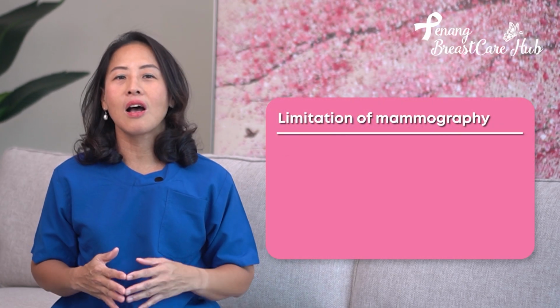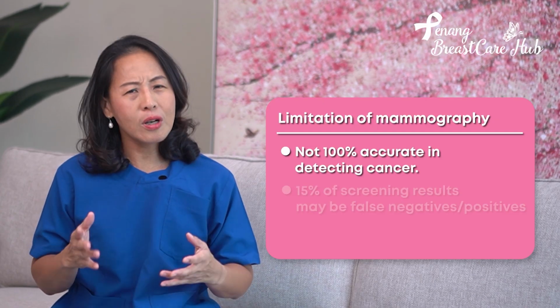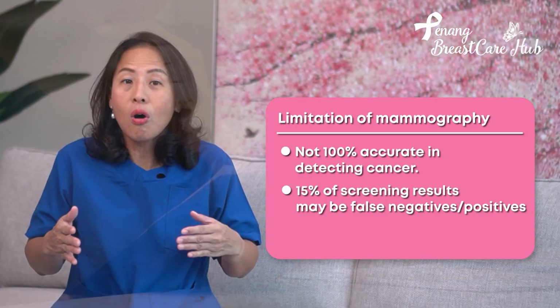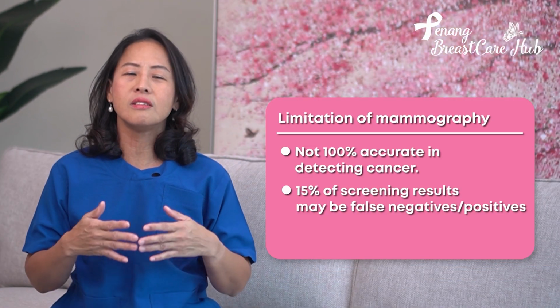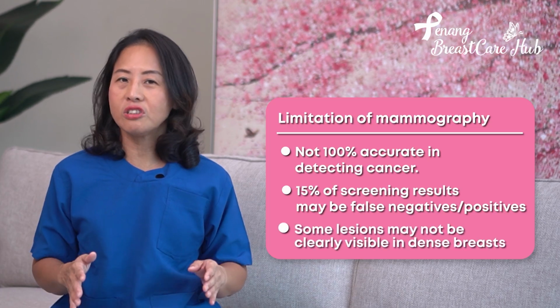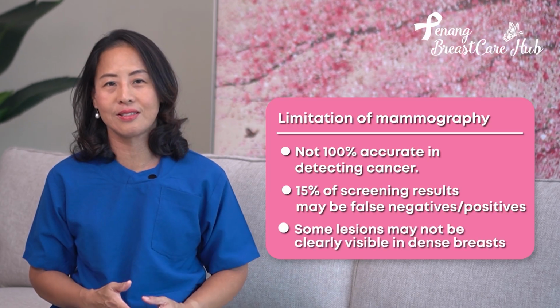Screening mammograms are also not 100% accurate in detecting cancer. Approximately 15% of screening reports can be false negative or false positive, resulting in unnecessary anxiety to the patient. Some lesions are also not well seen on mammography, especially in dense breasts.